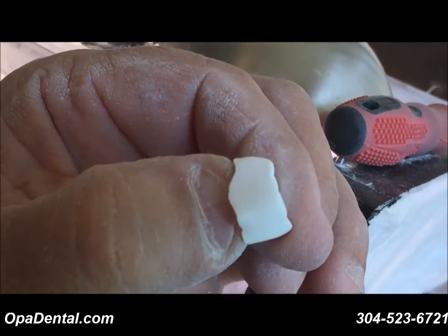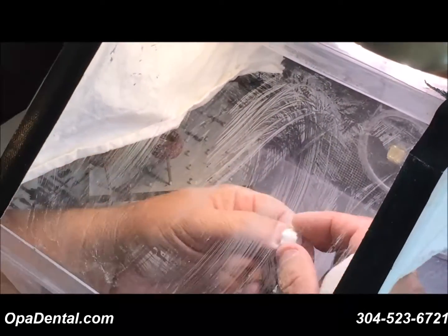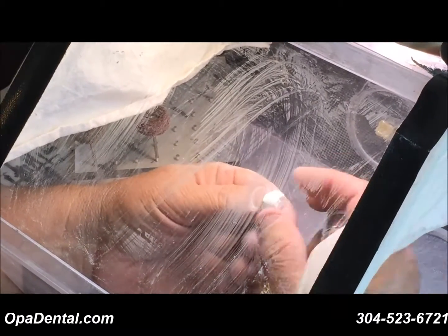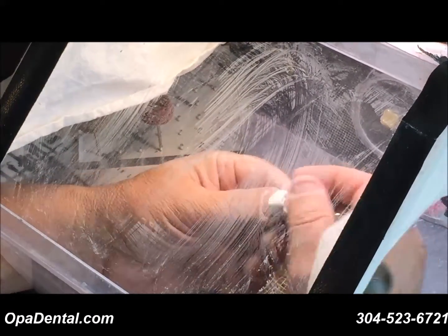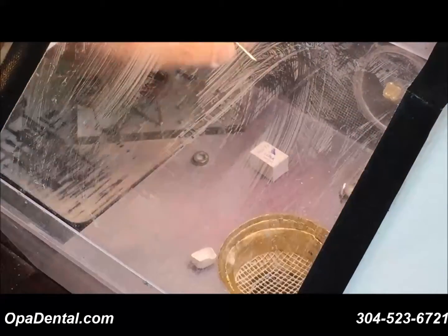Nice and smooth and ready if you're going to dip the restoration or paint on some pre-staining liquids. If it's just regular translucent material or super translucent, or if it's pre-shaded, once again you're ready to sinter.